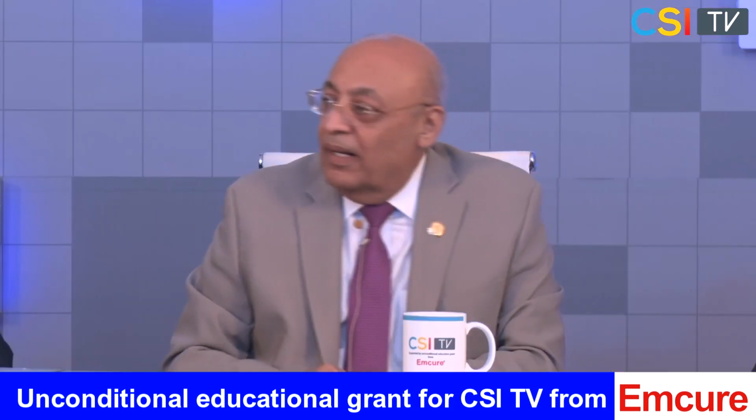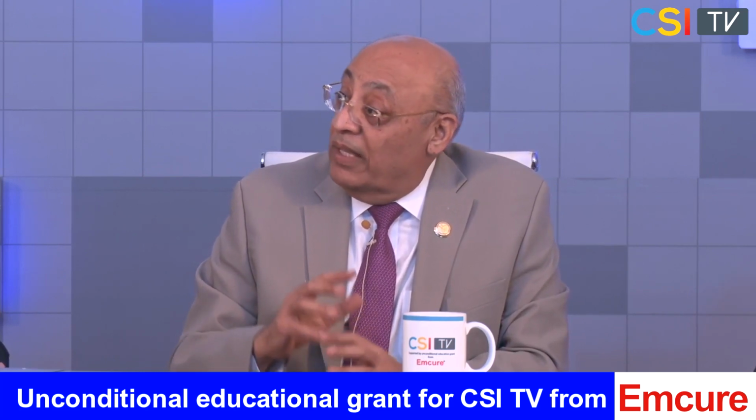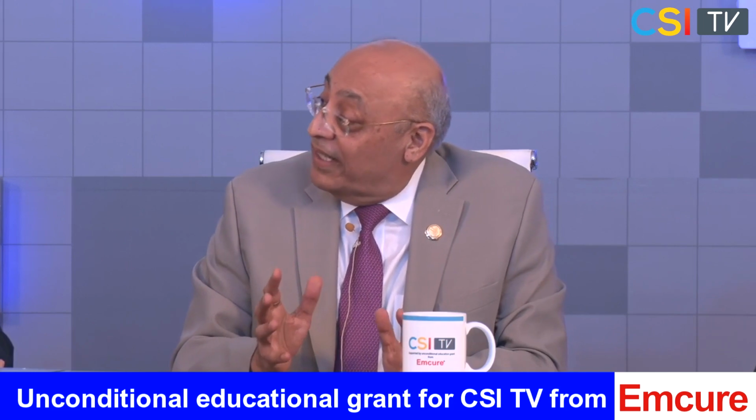Let me ask a question, Nitinji, of Jeroen. GLS, as you know, is global longitudinal strain, not the regional one, but essentially the global. And all that is just based on the convenience of measuring it.